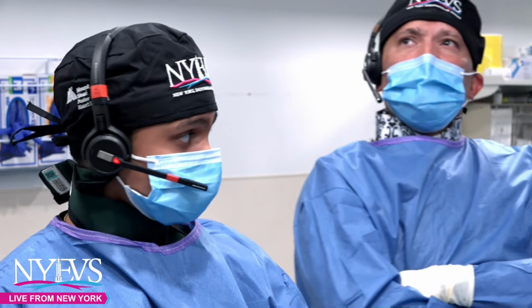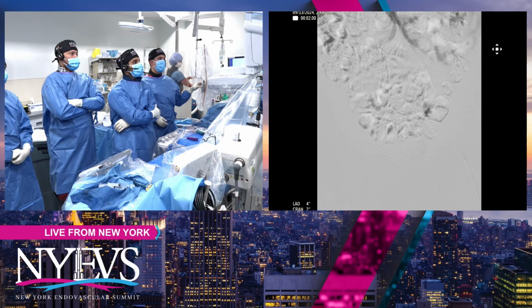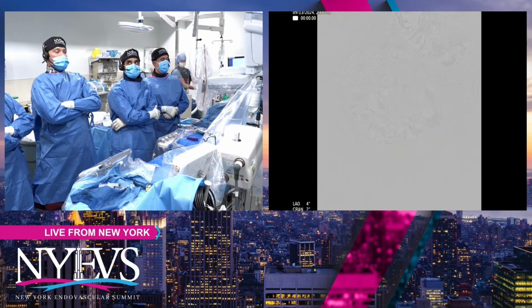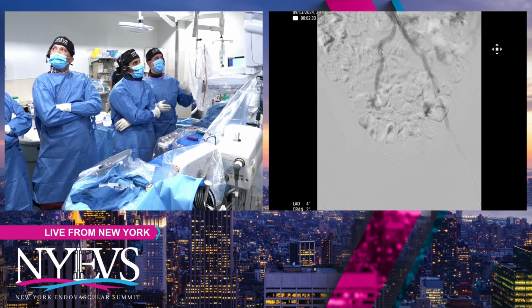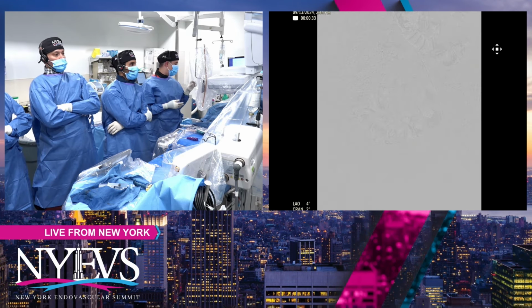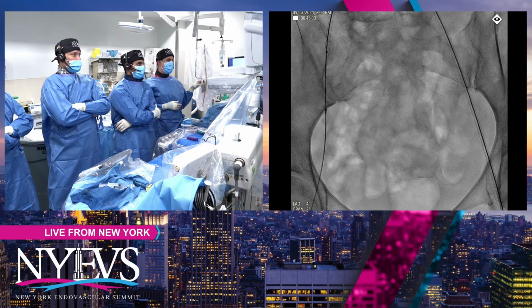Right, so we did a diagnostic angiography. We got the left access right here. For the sake of time, we took an iliac angiogram. Like Harsh talked about, the patient has kissing stents in the iliac. There's a little bit of disease in the right common iliac, as you can see, which we did a pullback gradient on, and it was negative. So we just went up and over with our regular up and over technique.